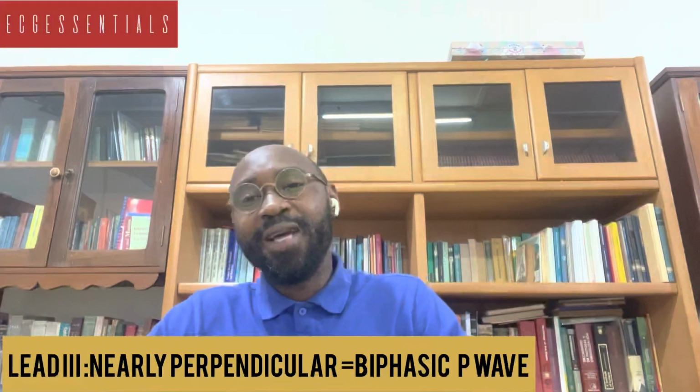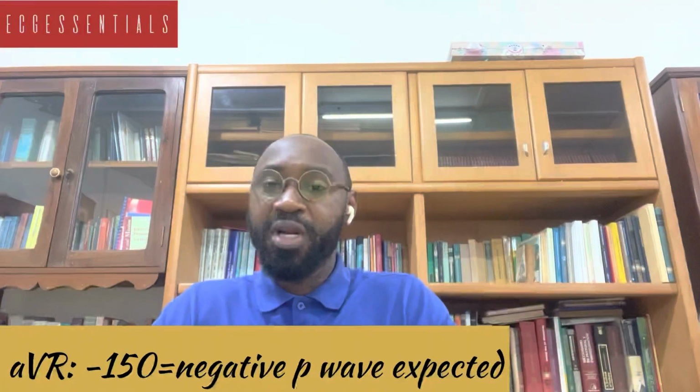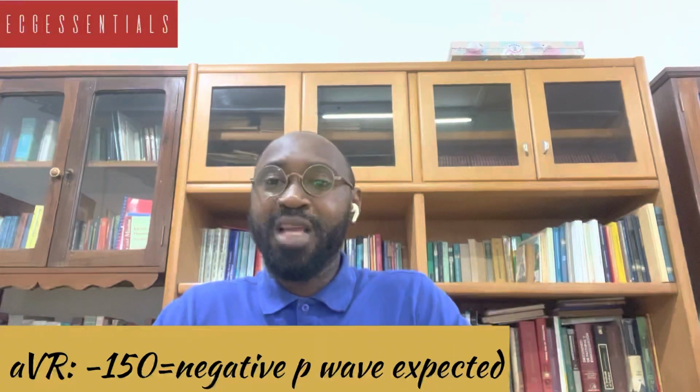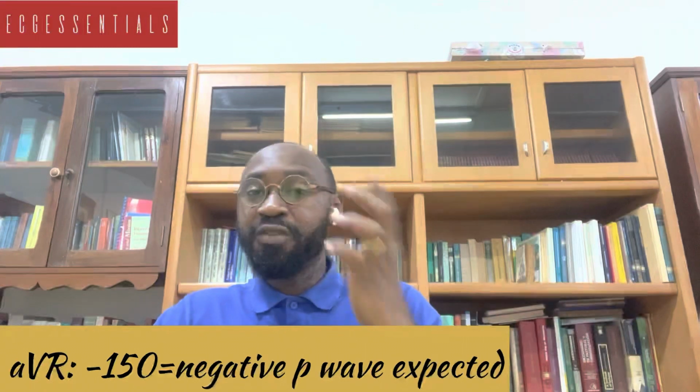Lead AVR, that is the most rightward of all the leads, will rather see the current as moving away from it, because 0 to 70 and then minus 150 is far off. So the current is like it's moving away from it. And so we generally expect a negative deflection for the P wave in AVR. So that does it for the limb leads.